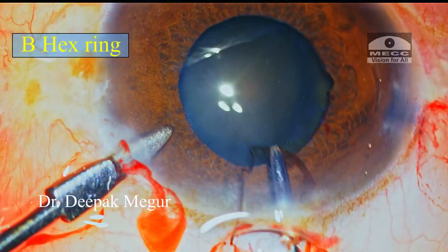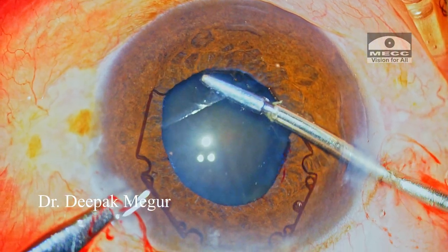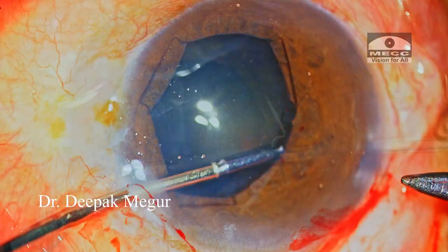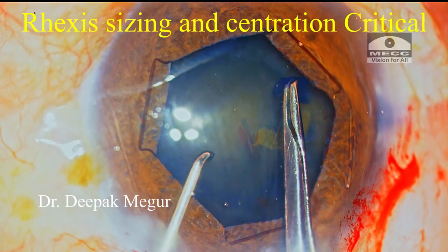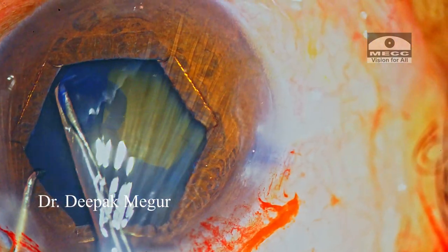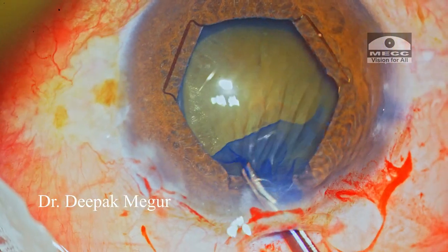I am using the B-hex ring now, but if the zonular dehiscence is gross — more than what I anticipate — and it becomes difficult to salvage the bag, I would remove this and use capsule hooks instead, which would support both the capsular bag and provide mechanical pupillary dilatation. I always prefer using a forceps to do my rhexis in eyes with loose zonules. Sizing and centration of the rhexis is extremely critical as I'm aiming to achieve an optic capture. A bigger rhexis is good for managing the nucleus, but optic capture becomes difficult. I have a well-centered, adequately sized, approximately 5 mm rhexis in this case.